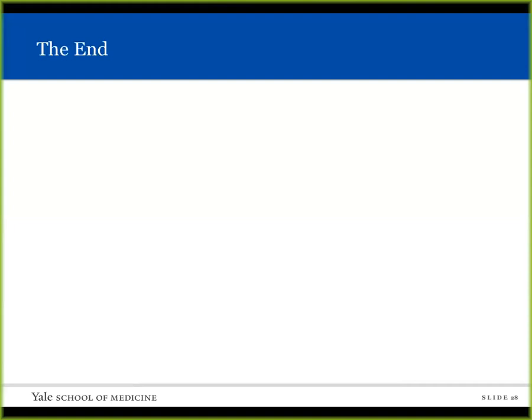The Moses technology is a different modulation of the pulse, and the one that we were testing from the VA was shock pulse. That one has a built-in Moses technology anti-retropulsion, which I think is kind of kitschy. It wasn't as strong. I think to get the 120 watt laser here, they had to change the fuse boxes to accommodate the wattage. Oh, really? Only the VA or SMC.